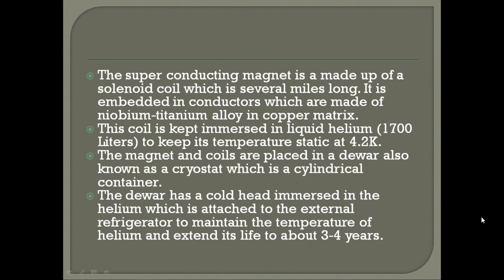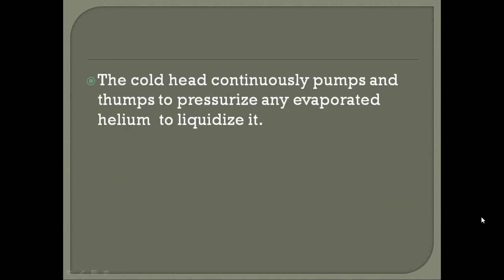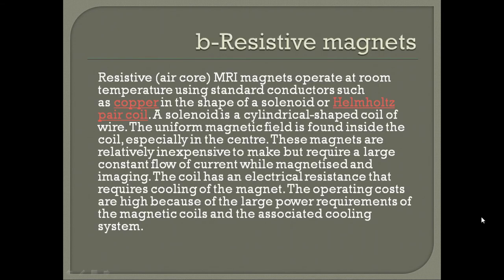The Dewar has a cold head immersed in the helium, which is attached to the external refrigerator to maintain the temperature of the helium and extend its life to about 3 to 4 years. The cold head continuously pumps and thumps to pressurize any evaporated helium to liquidize it.